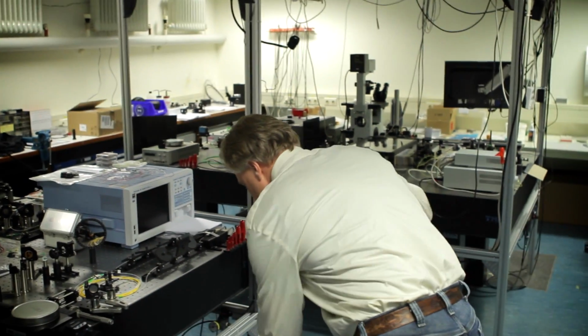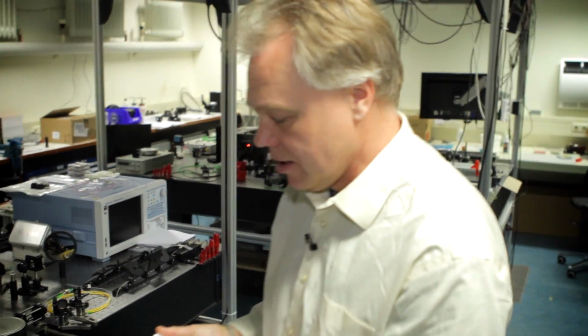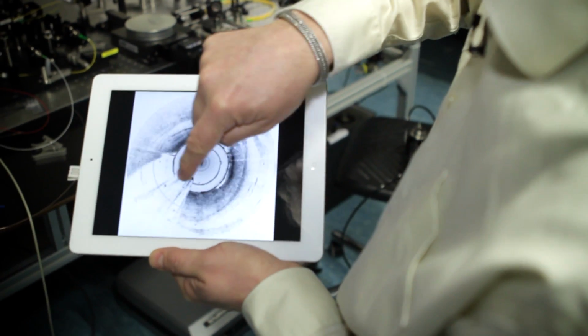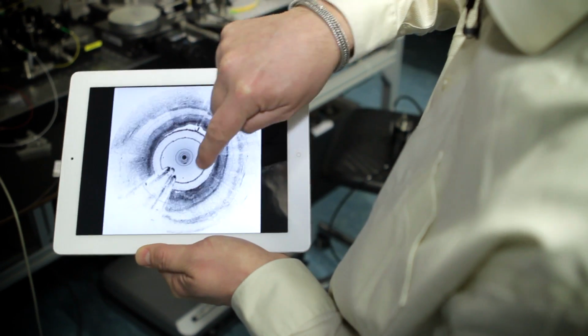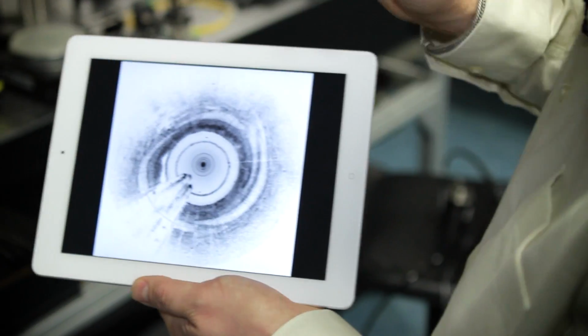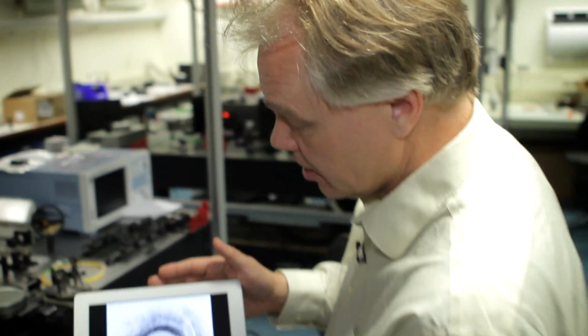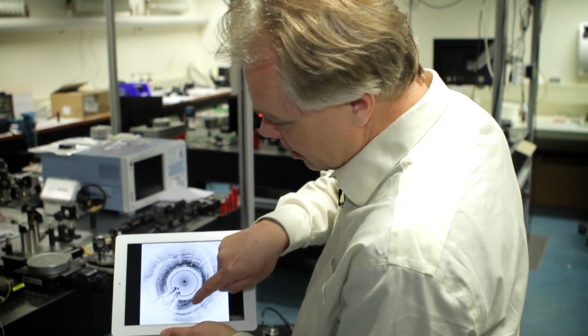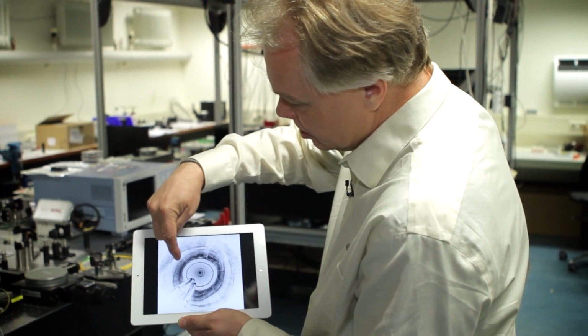And here I have a video of the lung. So what you can see here is the catheter sheath, that's the protective material that is sterilized. And then you can see here the walls of the lung. And this is a resolution that you can absolutely not reach with something like a CT or MRI. We can see, for instance, the cartilage rings here. Here are these white areas. Here you see a cartilage ring.